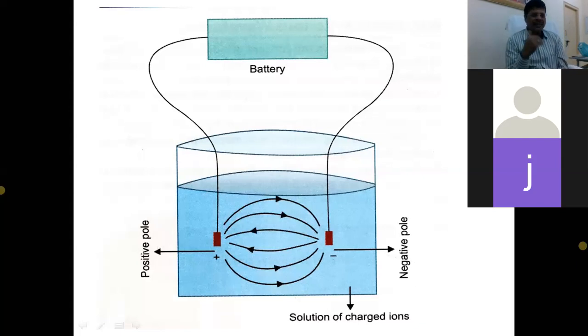Okay. So the next part we have to understand, if at all you have to make any sense about the physiological basis of the ECG, is that in the heart, at any given point of time, many areas are getting activated. So there is a creation of many dipoles.